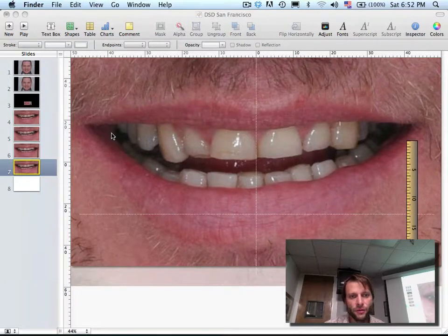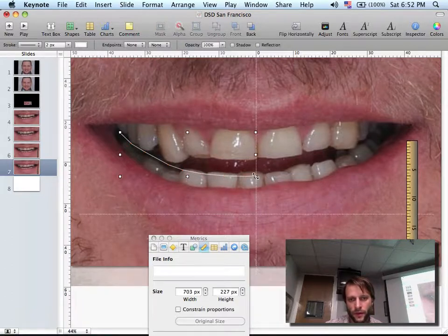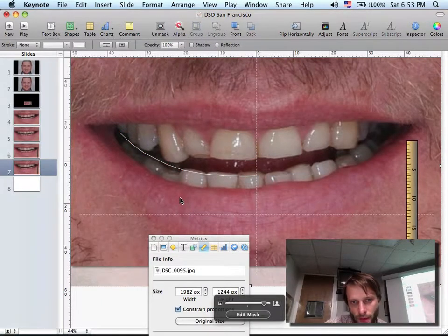So if I have this relation on the posteriors that I think is nice, I can just bring this line, and then following the lower lip I can continue and do the curve. Now, do you need a little bit of skills to draw this curve? Yes, you need a little bit of skills.